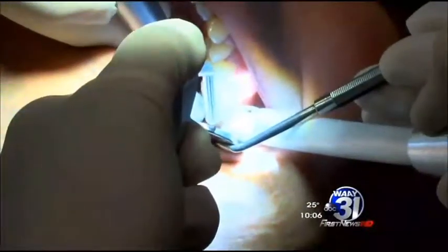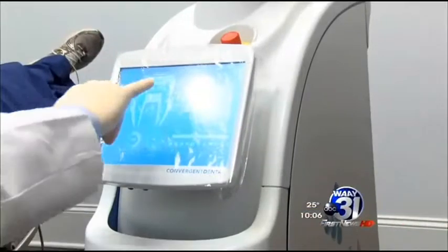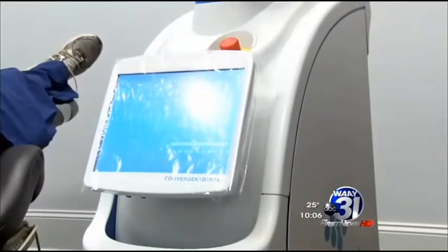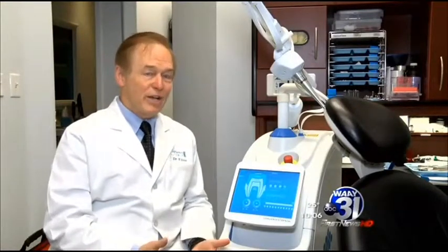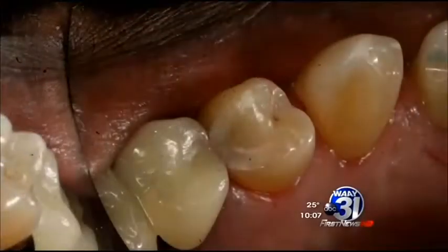So how did a dentist like Wilson learn to use this technology? I've always had a huge interest in lasers. He's not kidding. Dr. Wilson loves talking lasers and his new toy. They modify the normal CO2 laser wavelength, which is like 10,600 nanometers, down to 9,300 nanometers, which makes it work perfectly on teeth. Now, what does that mean? It just vaporizes tooth structure, so we don't have to use a drill, and we can remove the decayed tooth structure and do a cavity prep.